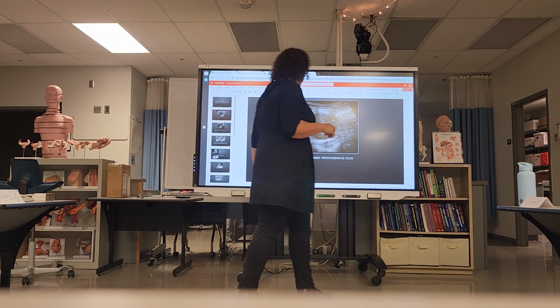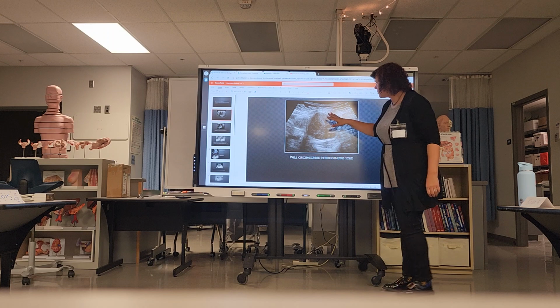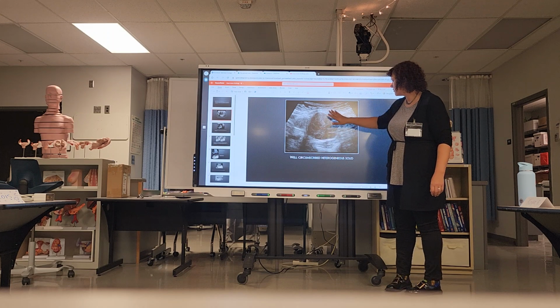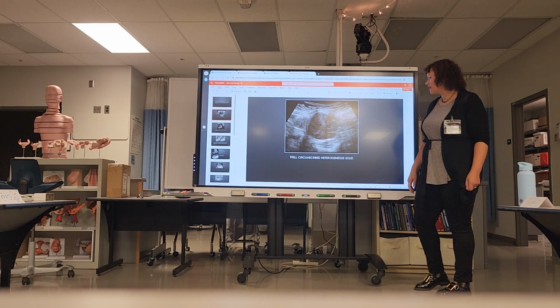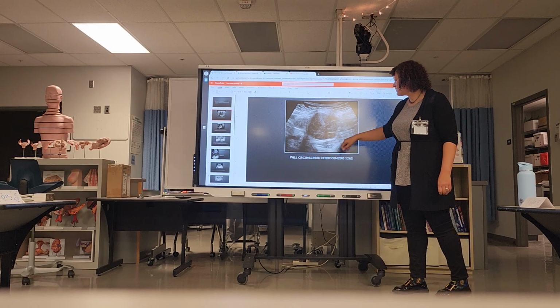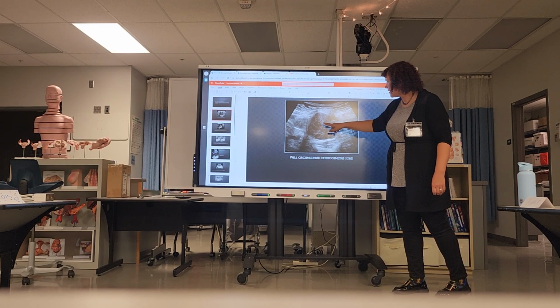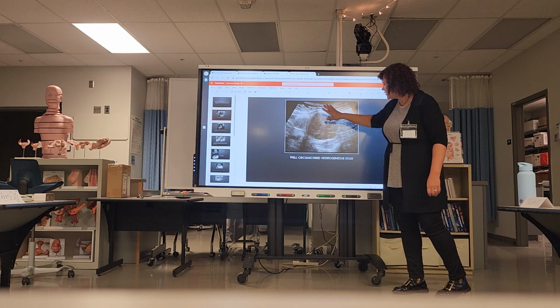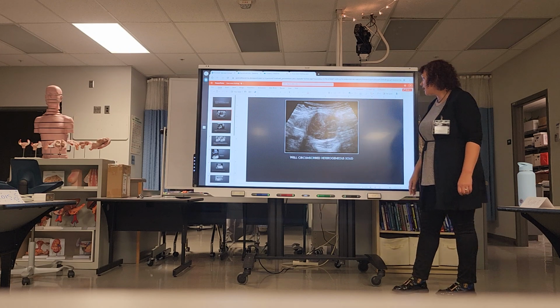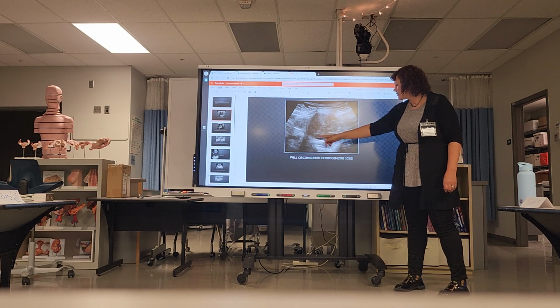I have the answers right here. All right, so how would you describe the echogenicity? Well circumscribed. No, don't write that. Yeah, it's heterogeneous. So we have some areas that are really hypoechoic, and we have some areas that are echogenic. So yeah, heterogeneous. And what about the borders?